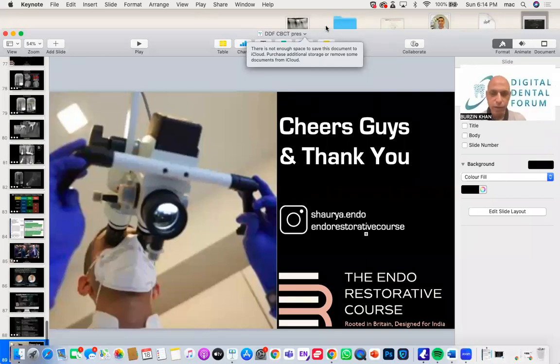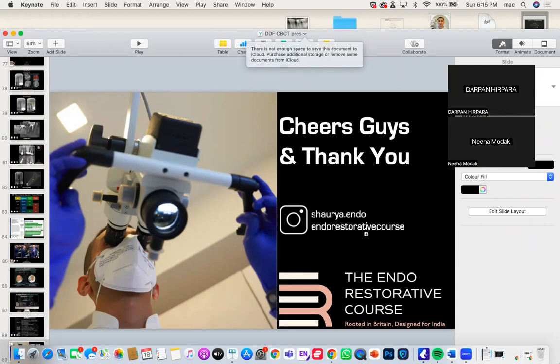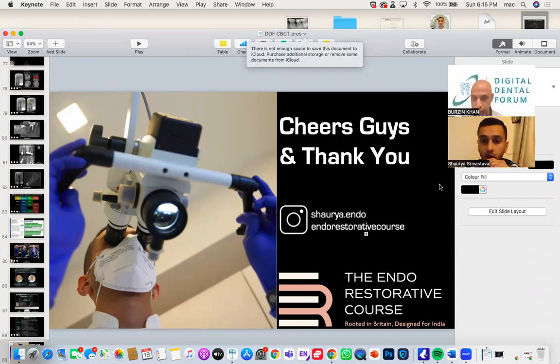Yes, absolutely, Shaurya. Thank you very much for joining us on our EdTech webinar series and for a very informative lecture with a complete overview on different endodontic lesions and how CBCTs help us in each one of them. Um, we're looking at some questions that have come up, and the first one is from Zishan. Any thoughts on guided endodontics?